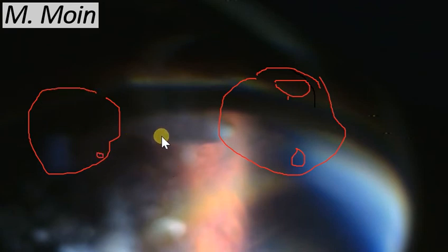If I just rewind this area and bring this in front, let me make a diagram of what we saw. If this is the eye and this is what we are seeing in this patient over here, if I just color this red, this is the nuclear fragment which has fallen off. It usually falls back, but when the patient is sitting up like this, it will be over here. So you ask the patient to look downwards, and if he looks downwards like this, then only when you're looking with a 90 diopter lens, you will see it in this area.